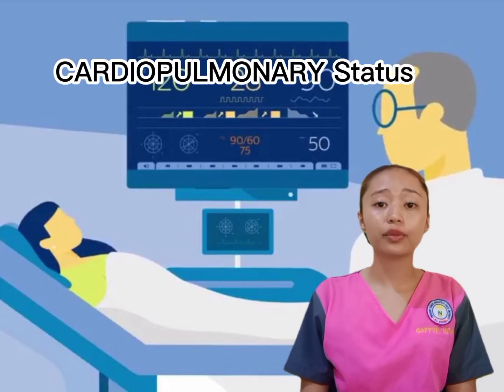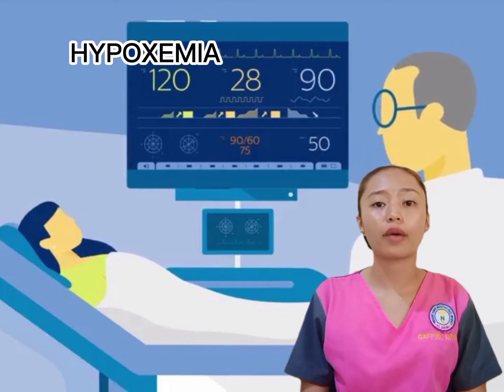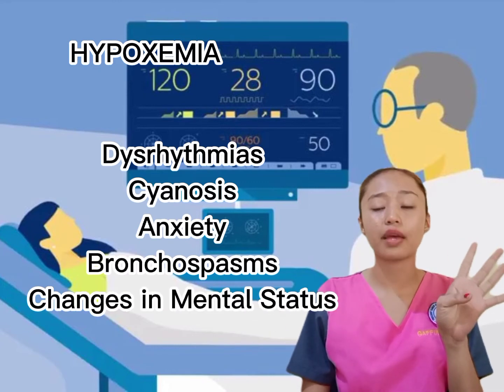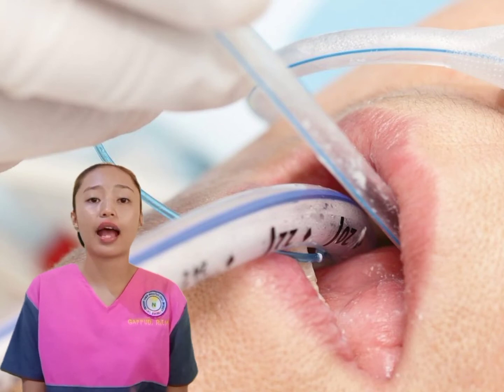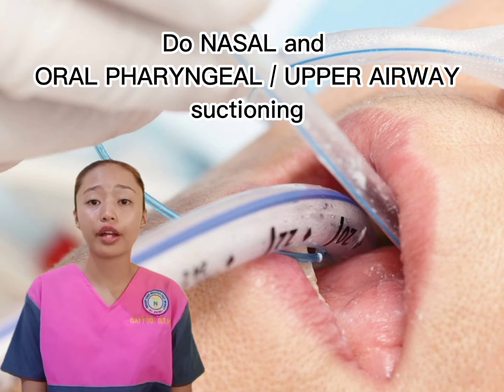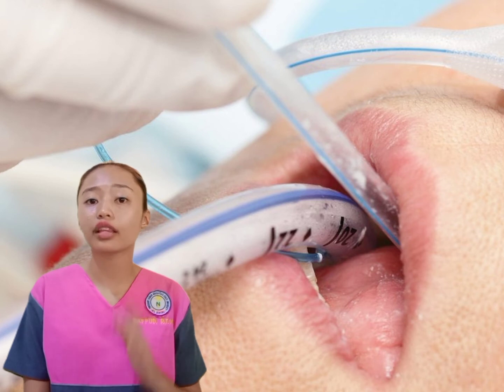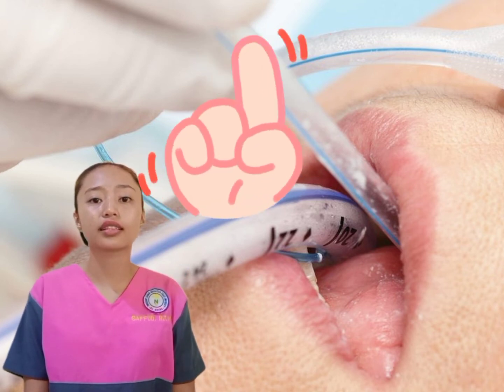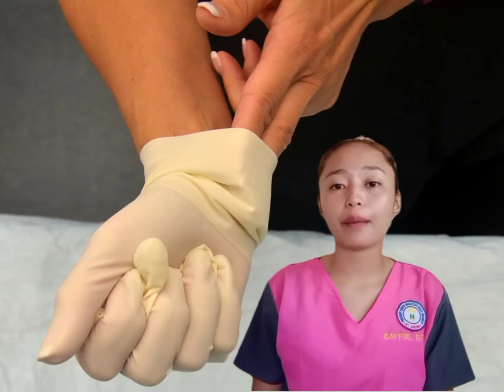Monitor the patient's cardiopulmonary status during and between suction passes. Observe for signs of hypoxemia such as dysrhythmias, cyanosis, anxiety, bronchospasm, and changes in mental status. Once the lower airway has been adequately cleared of secretions, perform nasal and oropharyngeal, or upper airway, suctioning. This removes the upper airway secretions. The catheter is contaminated after nasal and oropharyngeal suctioning and should not be reinserted into the endotracheal or tracheostomy tube.